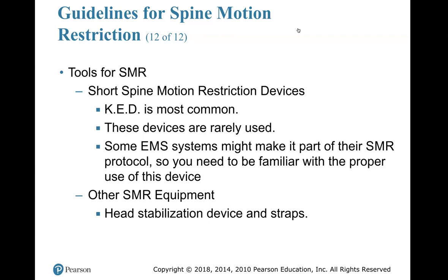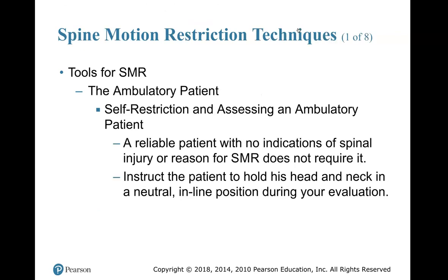Other SMR equipment, head stabilization devices, and straps. All right, the ambulatory patient. That is the patient, and I shouldn't have to tell you what ambulatory means, but I will. They're up and they're walking around. Self-restriction and assessing of an ambulatory patient.